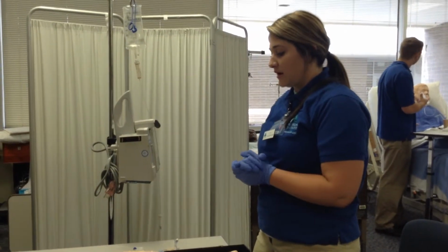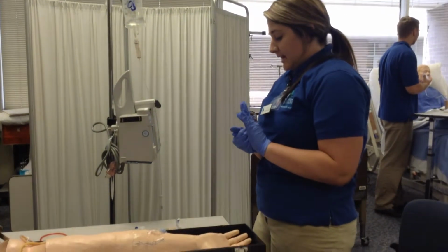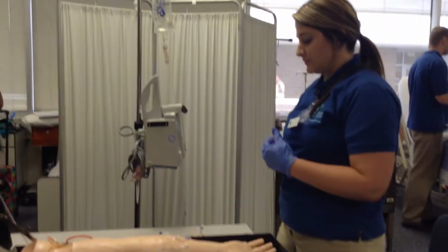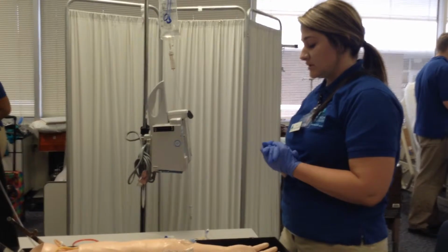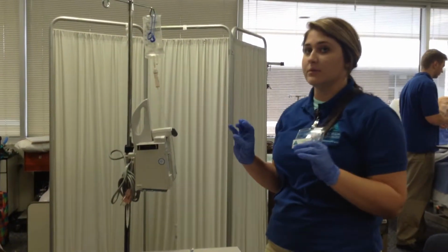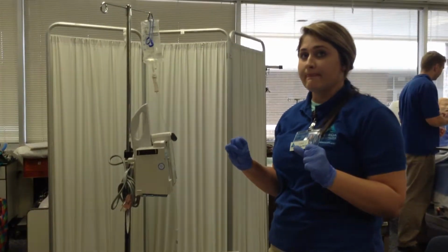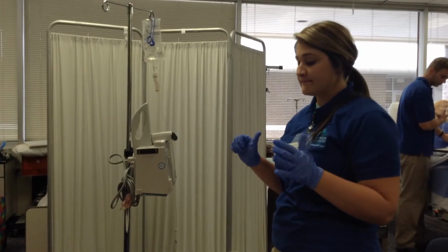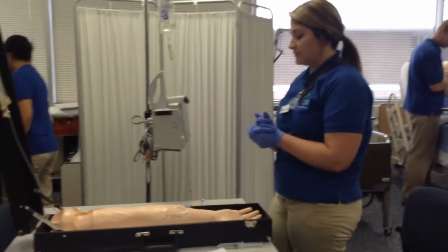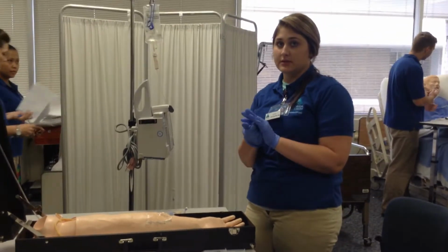Then, using my MAR, I would document the time, drug, dose, route, initials, date, and using the MAR intake and output record, I would document the volume of the fluid. And I would also note the condition of the IV site.